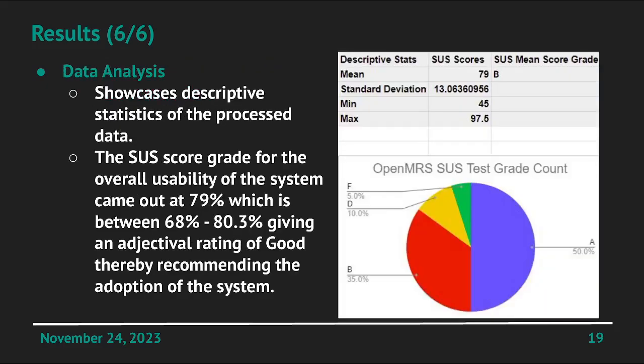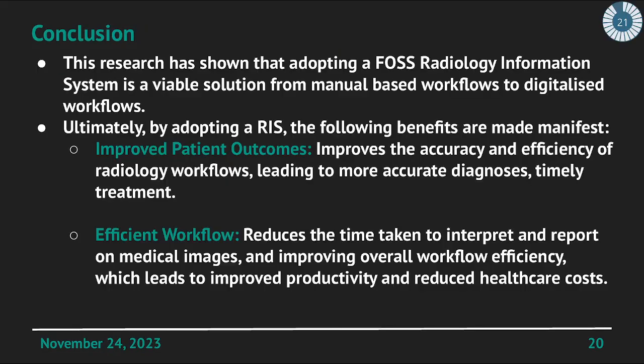Here, data analysis showcases the descriptive statistics of the processed data. The System Usability Score grade for the overall system came out at 79%, which is between 68% and 80.3%, giving an adjectival rating of good, thereby recommending the adoption of the system.